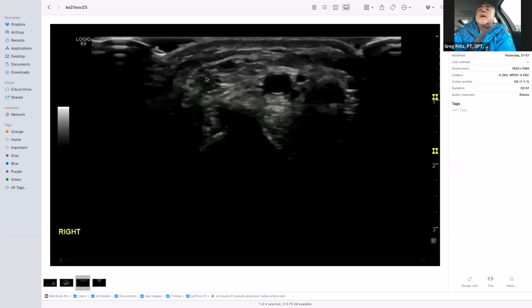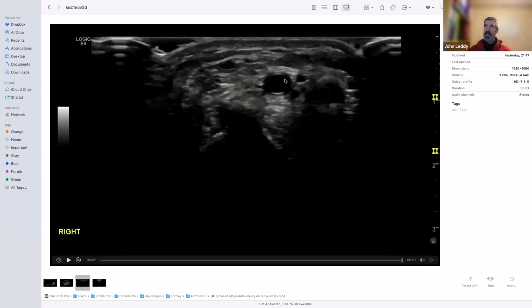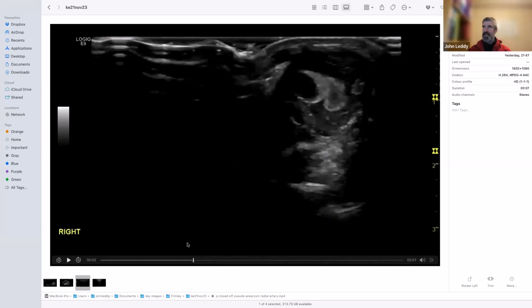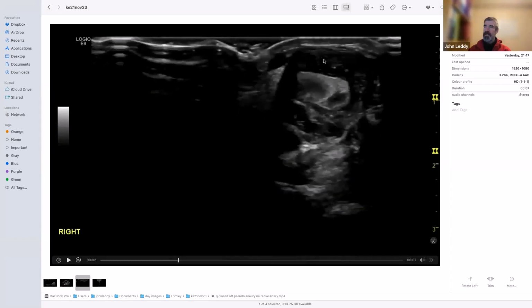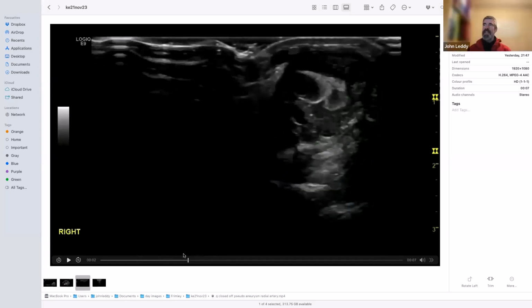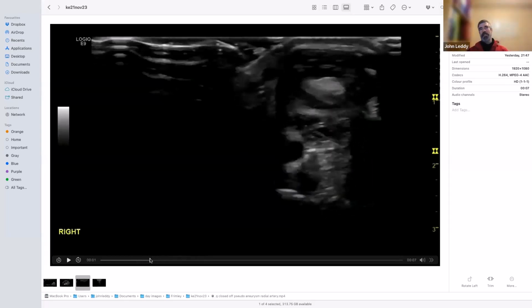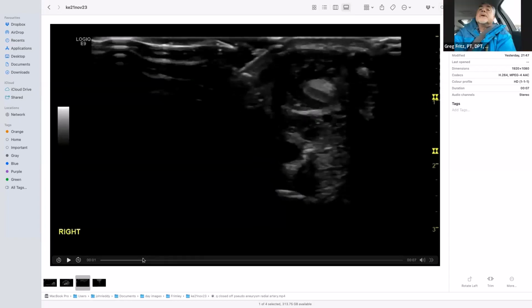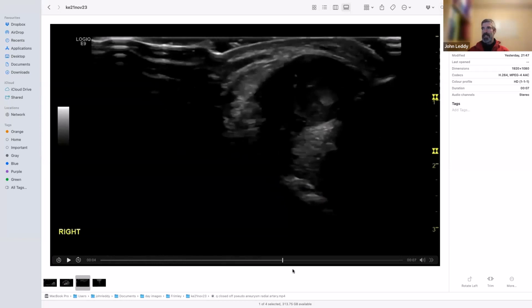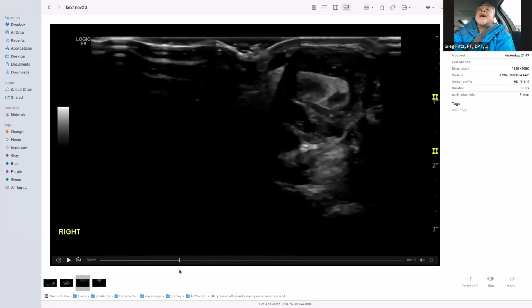Orient me here. This is the radial artery, or where it divides in the wrist. Okay. And then there's just a funny little lesion there with a very thick wall, like a ganglion, or I guess it's too thick a wall for a ganglion, and it has junk inside. Anything that doesn't look just plain and simple is not a ganglion. Gotcha. So this really is a cyst of some sort that has a cyst inside.